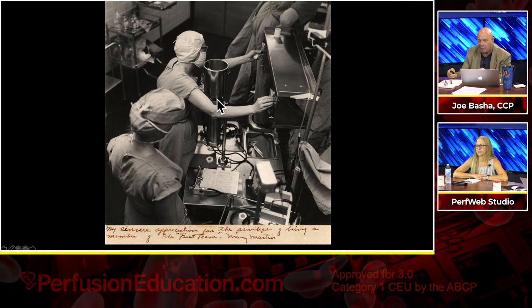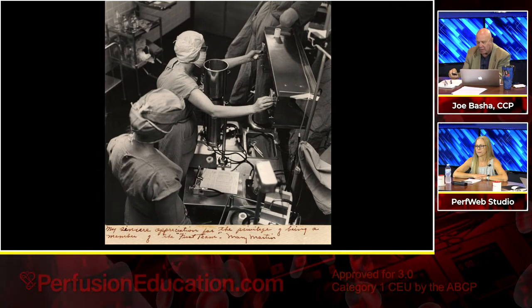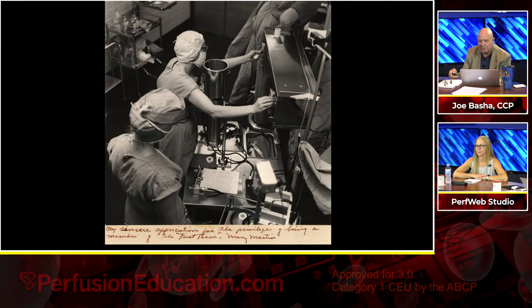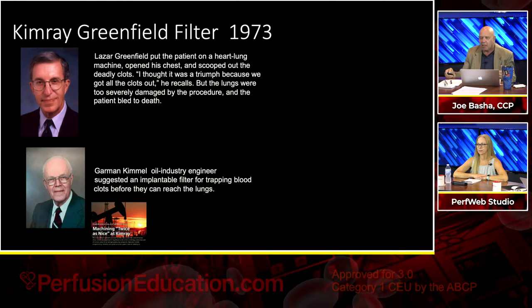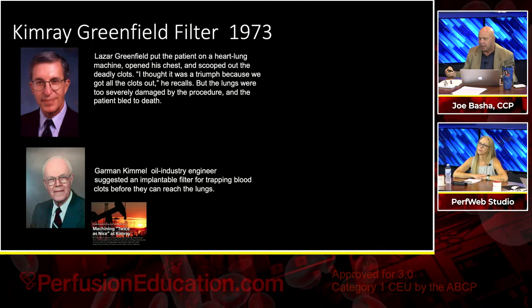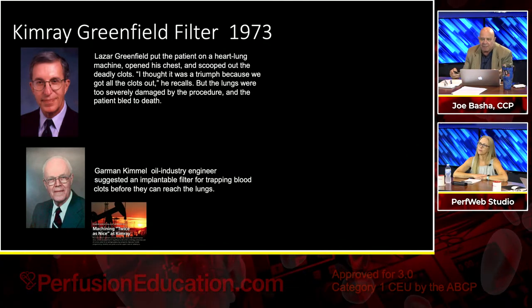And Mary Martin wrote a note. That's a very important photograph, I think, for us in the perfusion business. Now, another very good example of cross-industry collaboration is the Greenfield filter.